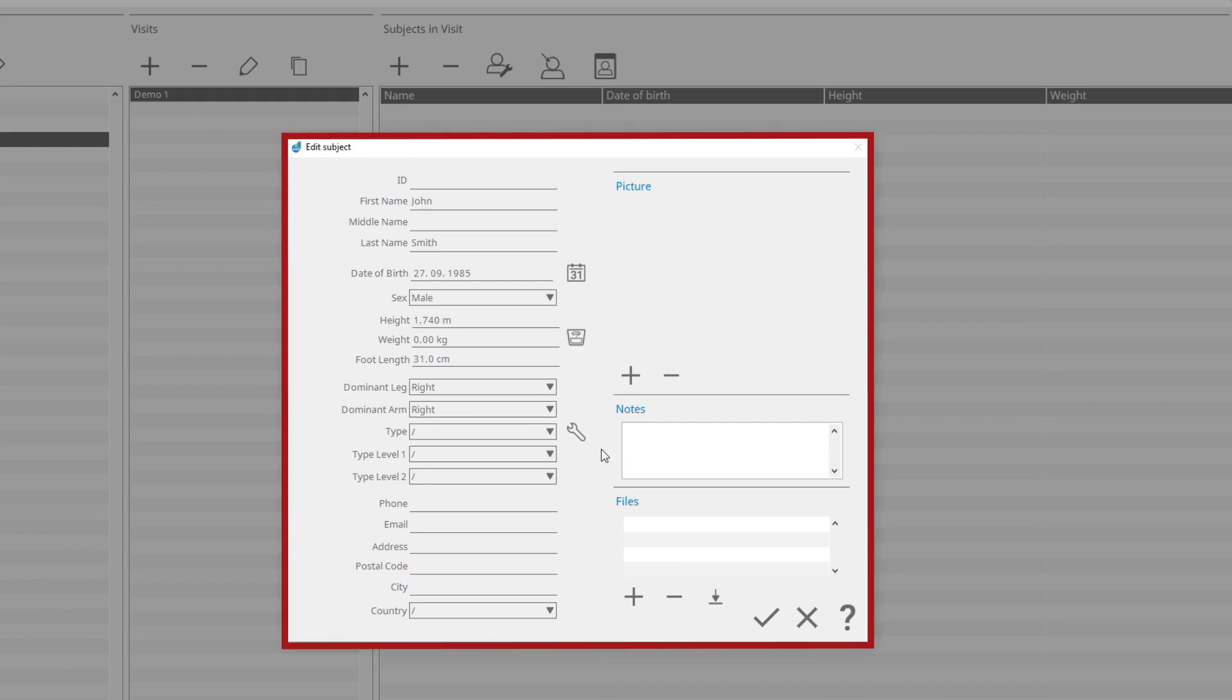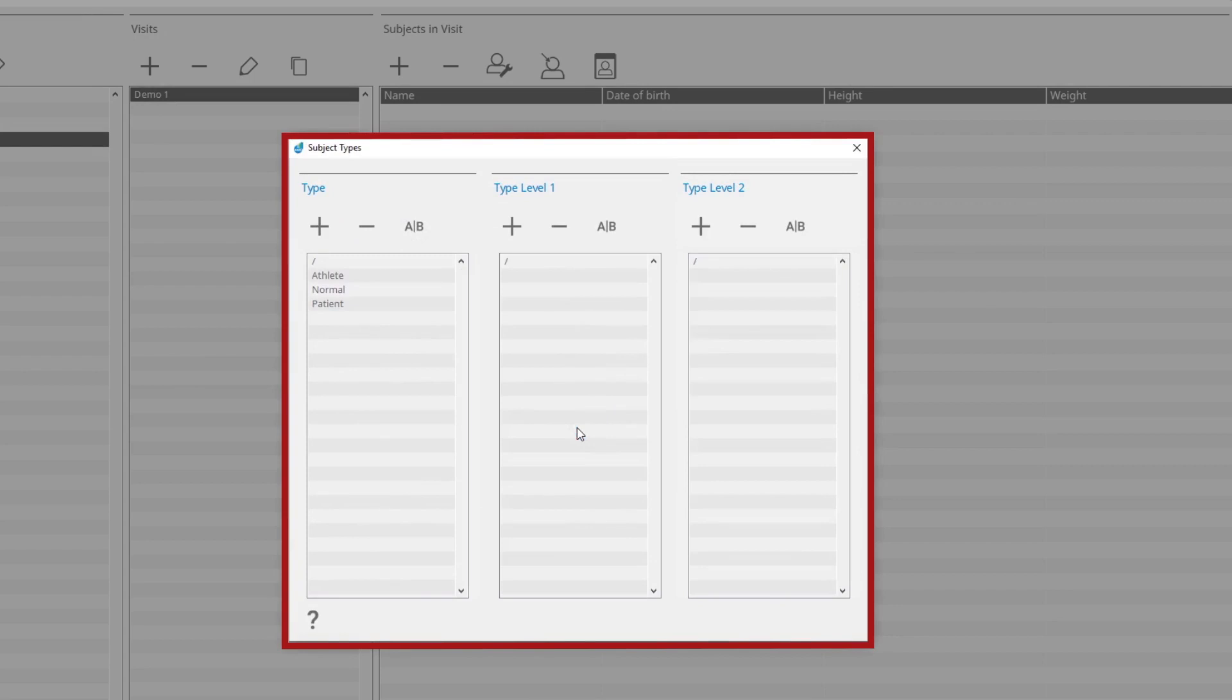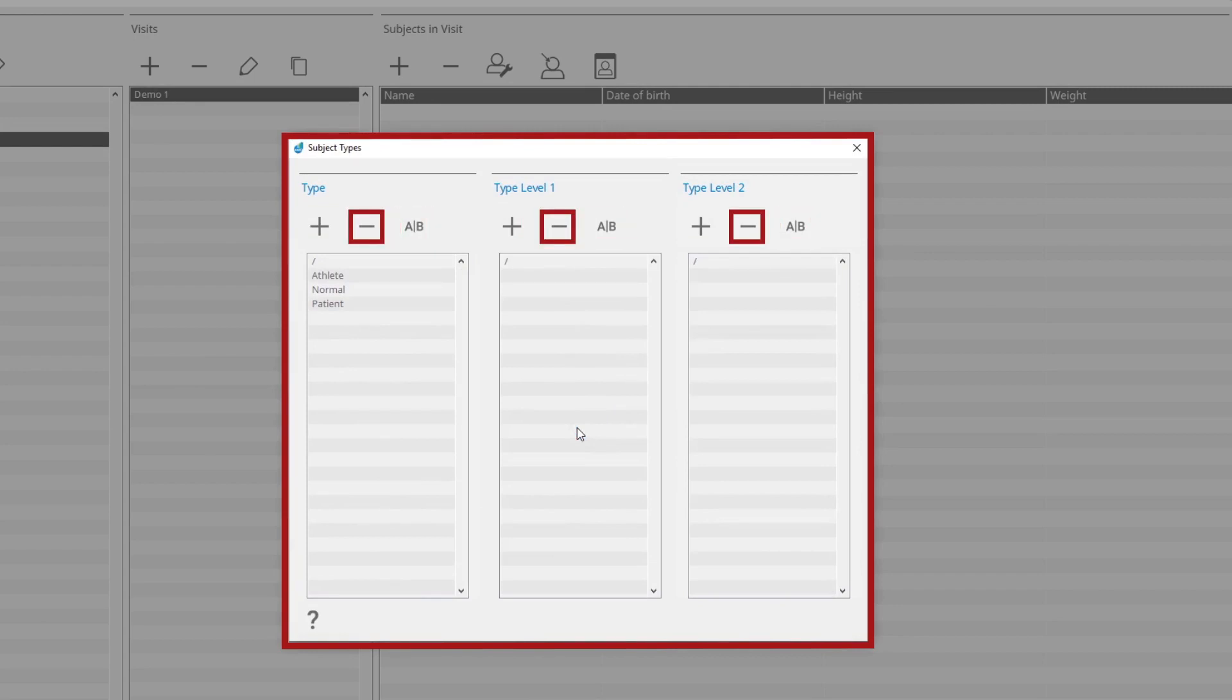Under the Type, you can define the subject's profile. If the profile doesn't exist, you can add a new profile by clicking the Manage Subject Types button. In the Subject Types window, you can add, rename, and delete all three type levels.